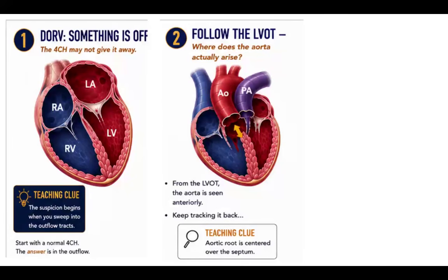All right. So now, when we're doing our heart sweep, we're like, oh, wait a sec. What's happening? Where's my aorta? Where's my pulmonary? Why is it connected here? And so this is where we're going through to demonstrate our crisscrossing.